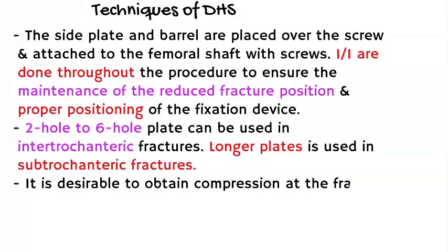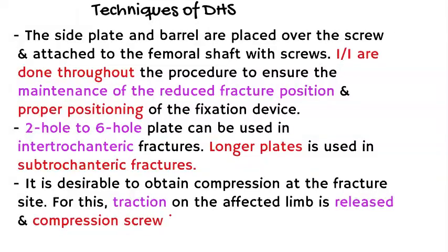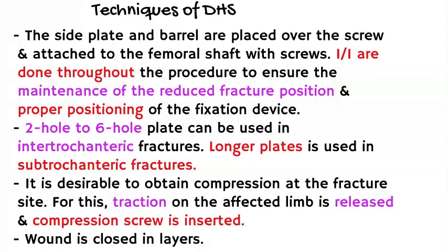It is desirable to obtain compression at the fracture site. For this, traction on the affected limb is released and compression screw is inserted. Then, finally, the wound is closed in layers.